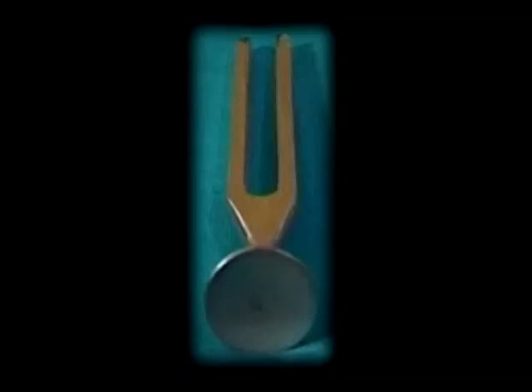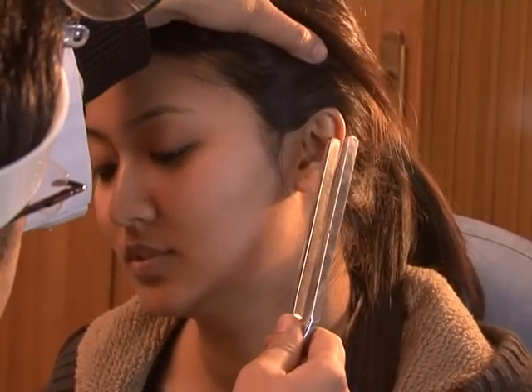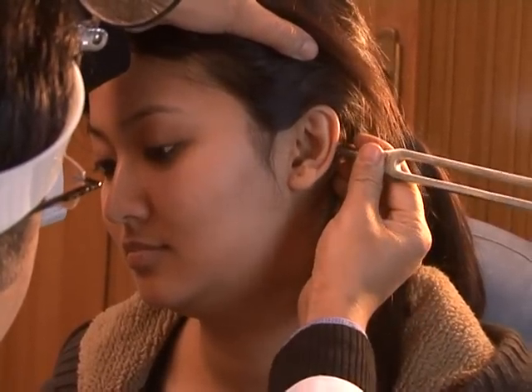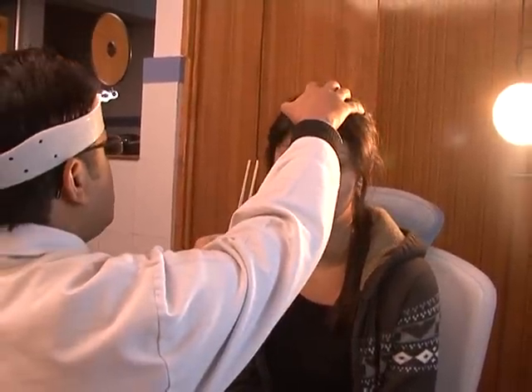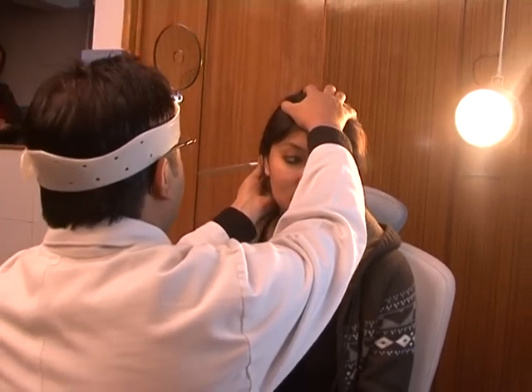After clinical evaluation, functional evaluation of the ear is done with a 512 Hz tuning fork, testing each ear separately, starting with the better ear. In Rinne's test, a vibrating tuning fork is placed first in front of the ear, then on the mastoid tip, and the patient is asked which vibration is heard better, and we interpret accordingly.